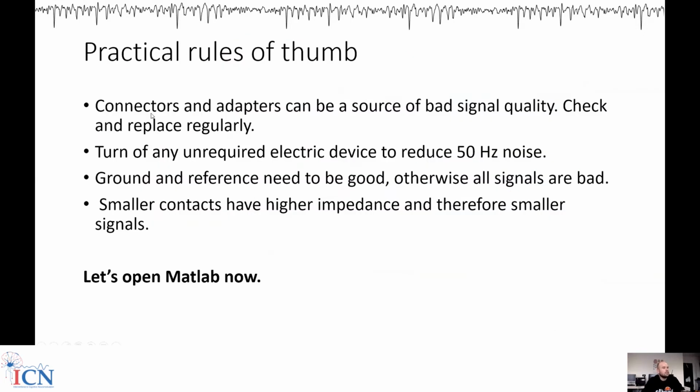Can I also ask a question? Sorry. I'm not very experienced with all these recording techniques, but why not, for example, use the earlobe as a reference? Because we now referenced the right STN to one of the left STN electrodes, and I don't understand why we now want the left STN signal basically in the right hemisphere. Wouldn't the earlobe, for example, be a more neutral reference?